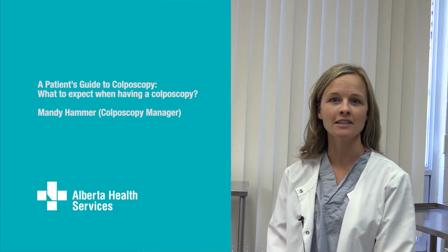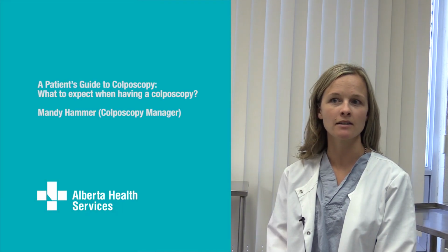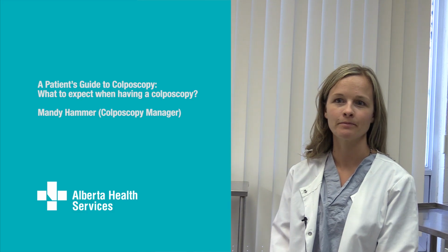A patient's guide to colposcopy. What to expect when having a colposcopy. You may have had a recent abnormal pap test and your physician has referred you to a clinic or specialist to have further evaluation and investigation.